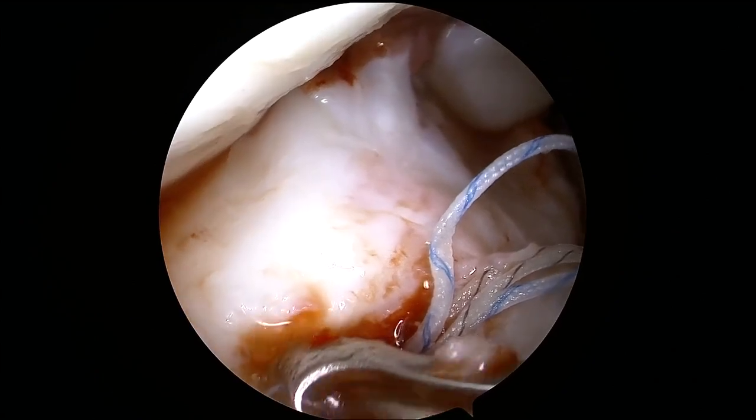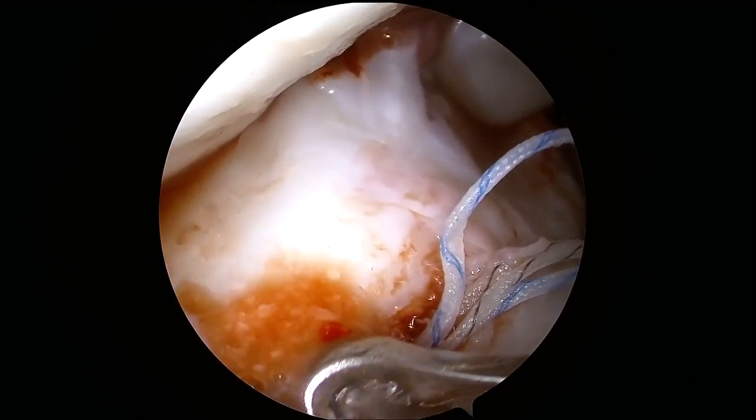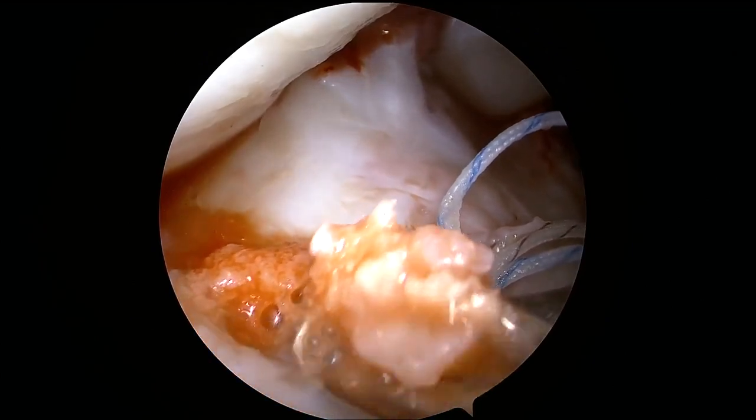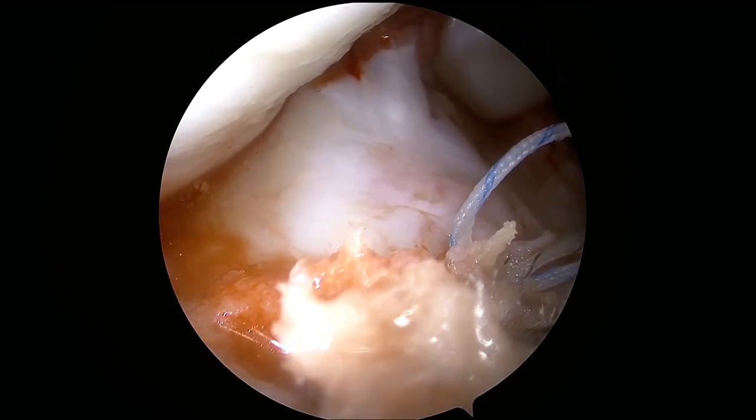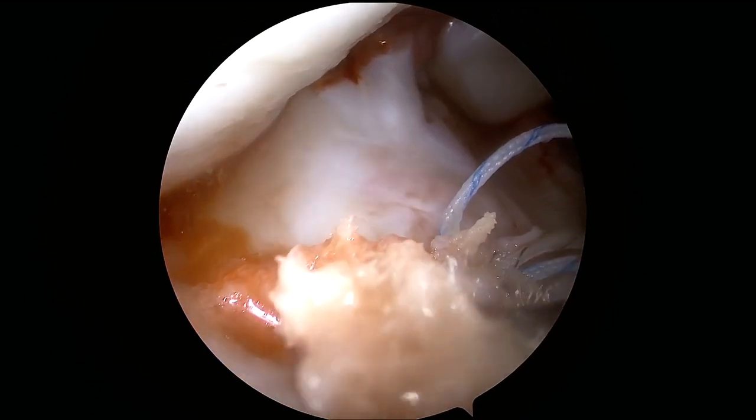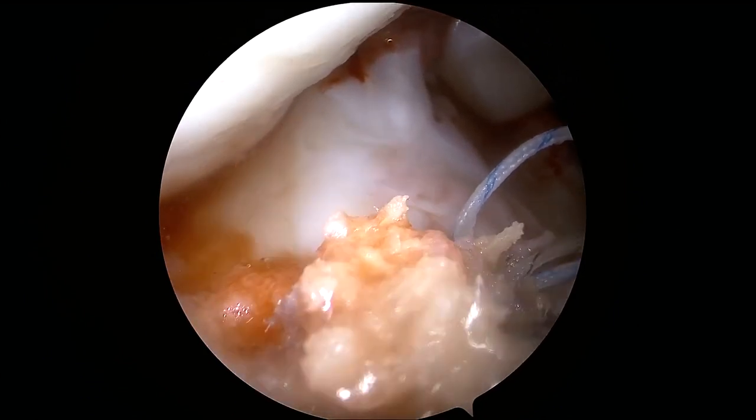An arthroscopic view of the second anchor placement is shown here. The second anchor is placed just anteromedial to the first anchor, and both are placed at the anatomic location of the anterior root attachment of the medial meniscus.